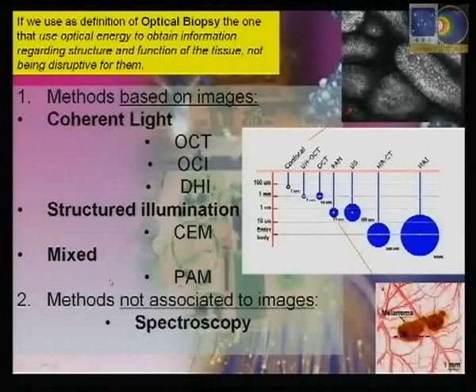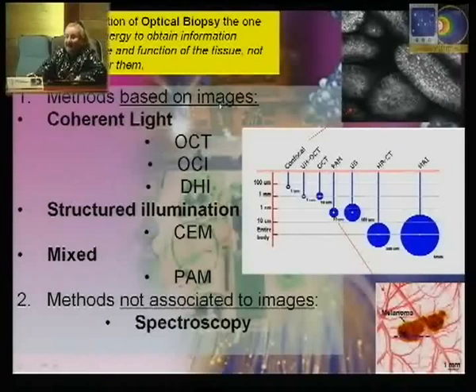What is interesting is that now methods that allow you to see the tissue allow you to make the diagnosis. That means they allow you to make the biopsy and the diagnostic procedures on images that look like the ones we have in the microscope.